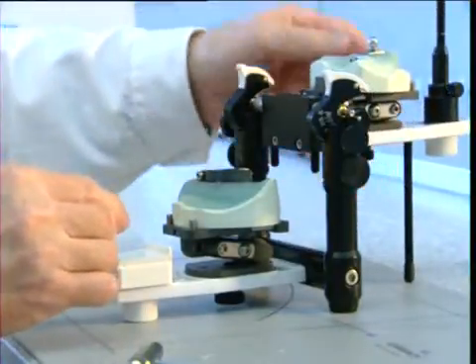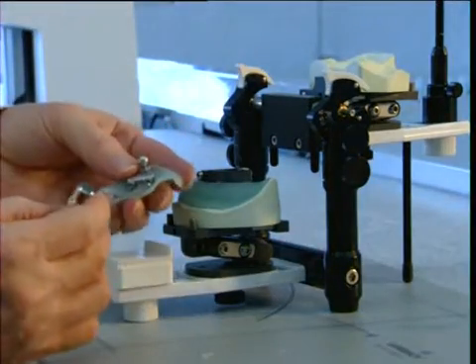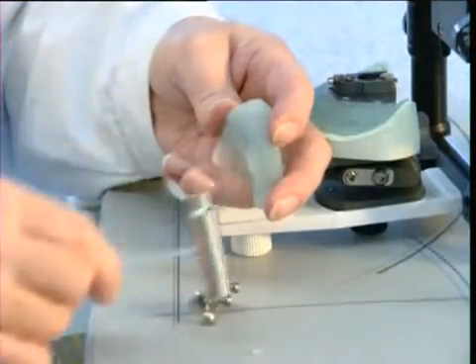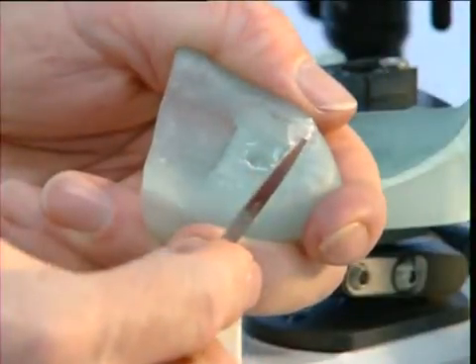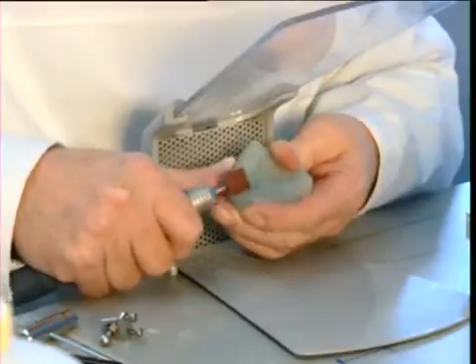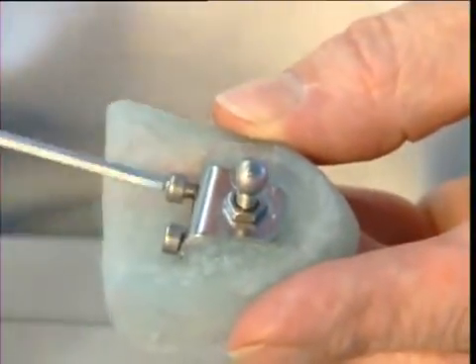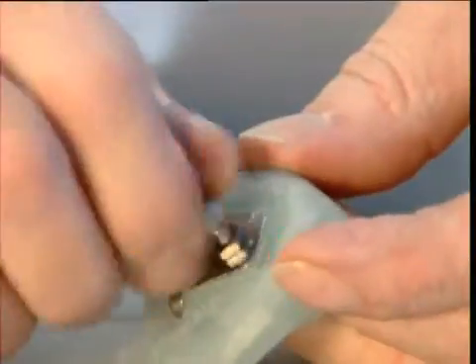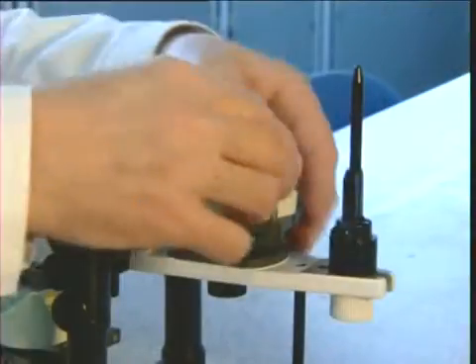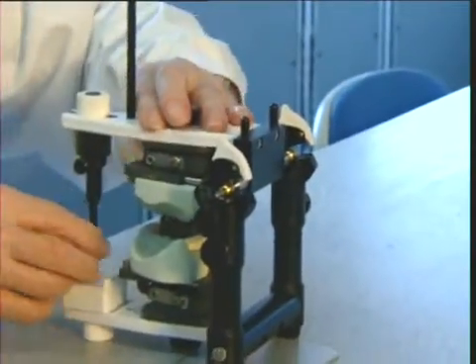Release the upper tray from the model and loosen the Allen screws and tracing ball to remove the pin holder from the tray. Remove the spacer tube and clean the tray. Reposition the pin holder, tighten it, and wind the tracing ball in again. The Centrofix intraoral registration instruments are now ready for use in the dental practice and should be checked on the articulated models.